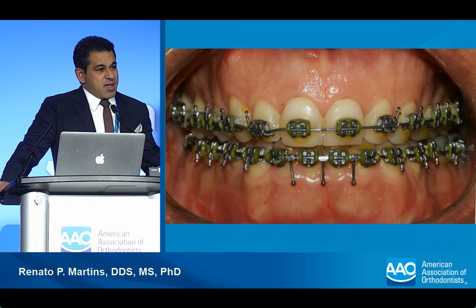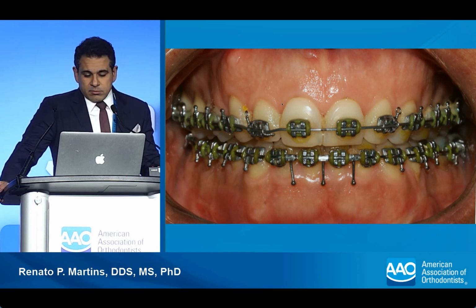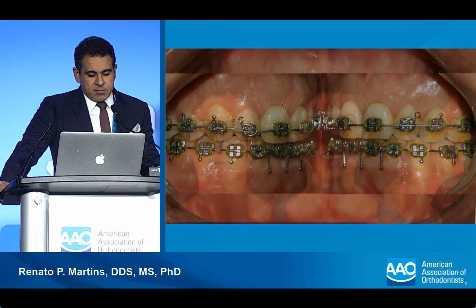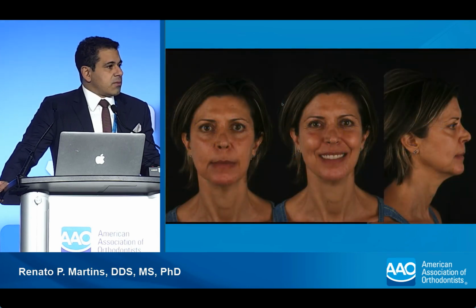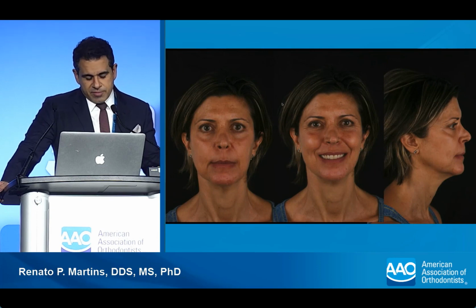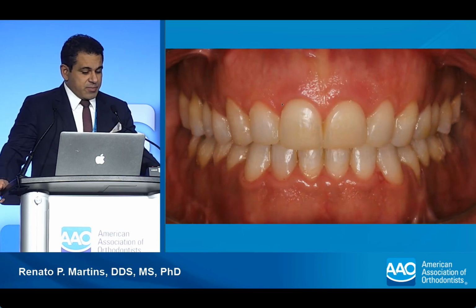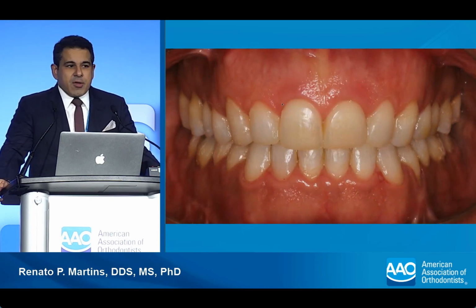And by 3 months, I had already done the bend that I needed, and she was ready. So I ended up finishing her case in 11 months, 3 months after surgery. And I never went back to aligners because by the time she could open her mouth, the case was done.